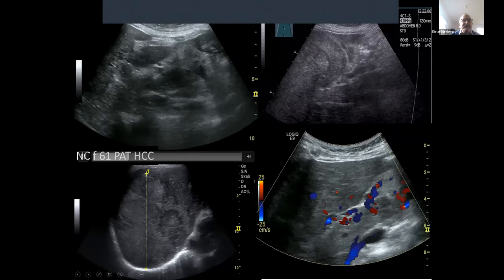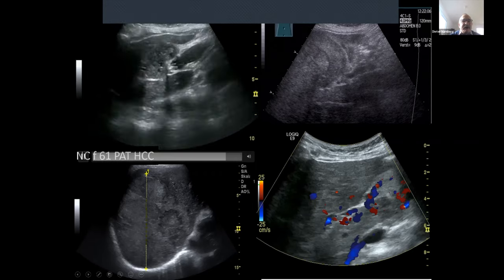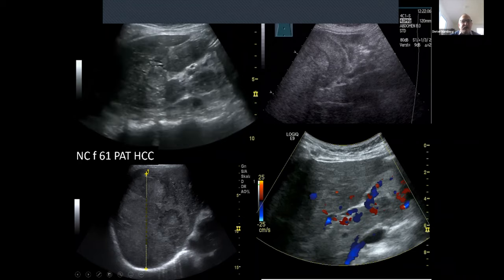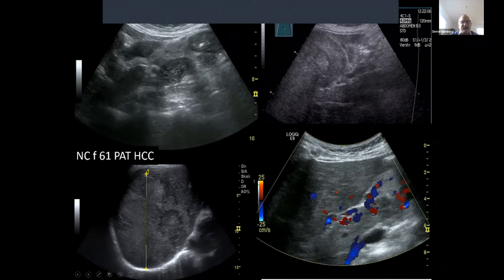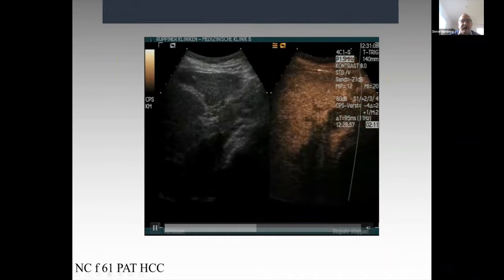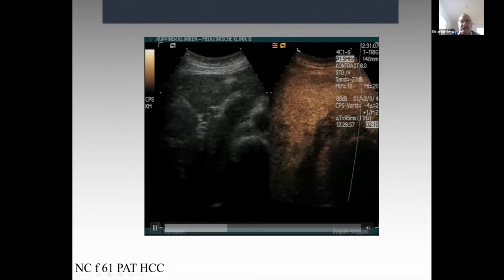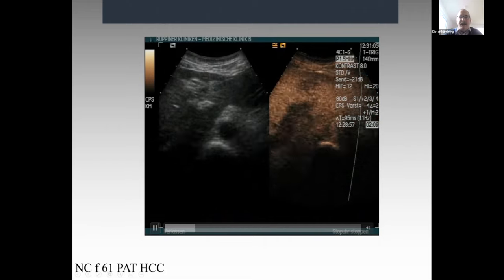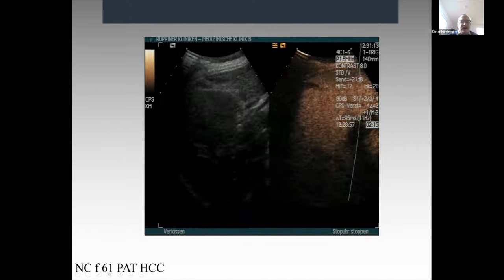You can see here that is a thrombosis. It's a little bit more echo-rich, inside the liver. We come back to the main portal vein, that is a confluence. Here the other one too, and two more: HCC and metastasis. In that situation in HCC, we used contrast media, and that is a portal vein, and you can see that we have an enhancement of the portal vein inside, and that means we have vascularization bubbles inside of the thrombosis, and that means it's a malignant thrombosis in HCC.